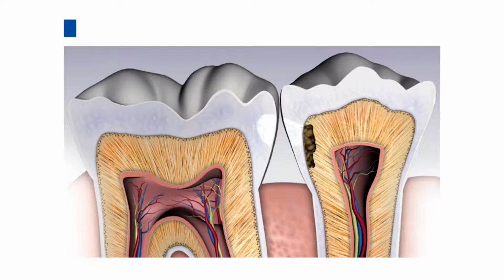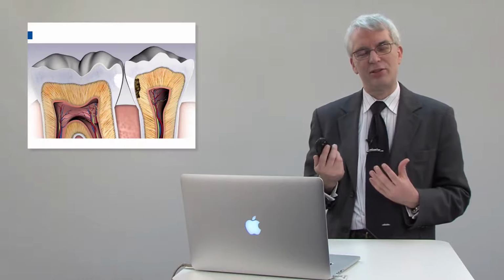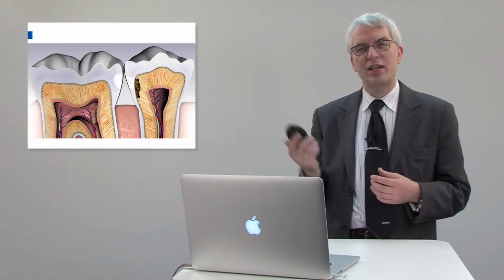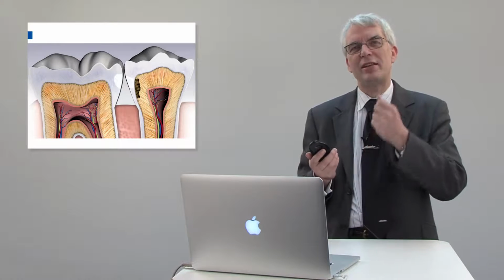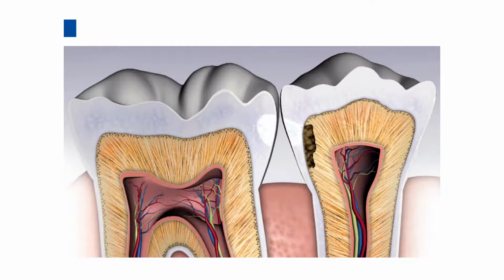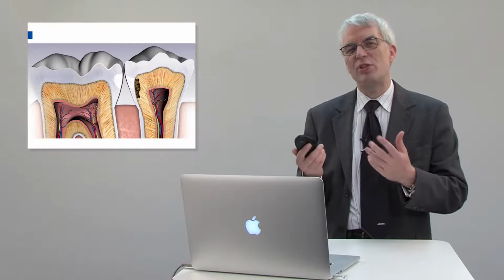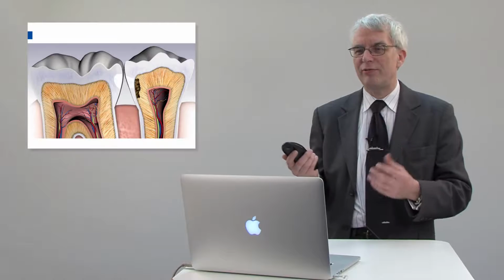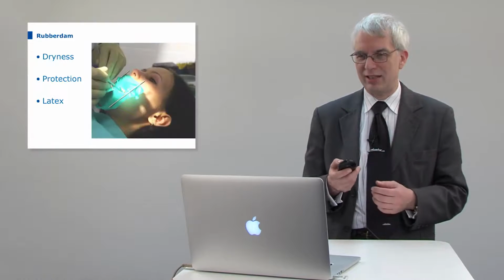Now, this is a picture here to show you what happens if you treat this interproximal caries. If you use Icon infiltration, then you avoid a big problem that dentists otherwise have, and that is re-establishing the contact point. In this picture here, if you would drill in and cut out the caries, it would mean that you have to re-establish that contact point. And that is one of the more difficult tasks. So Icon does not change the anatomical features of the tooth, and that's a good thing in this case.